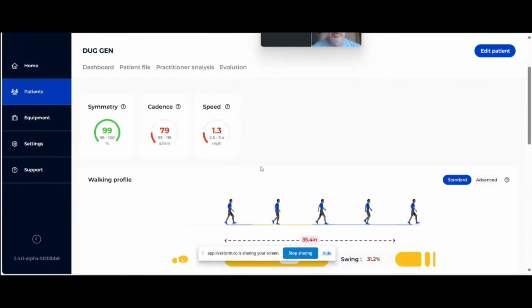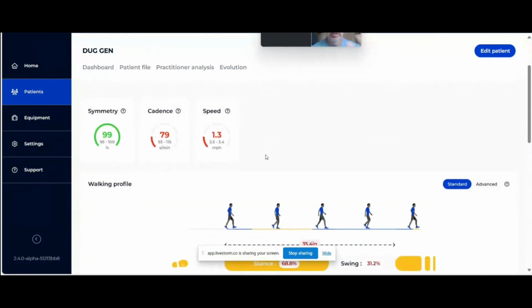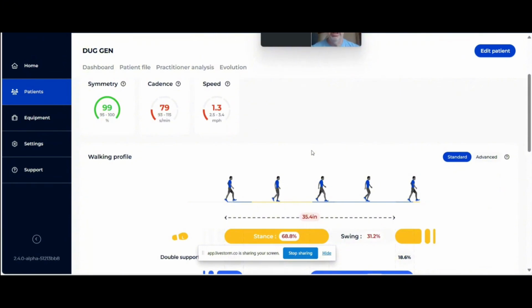But so obviously walking is very, very slow. So this person is about 1.75 meters or so. So they're definitely taller, and so their speed should be much better than 1.3. But like I said, it had more to do with balance, and some of it is biomechanical. Some of it is the influence that uncontrolled blood glucose levels, long-standing, actually have.